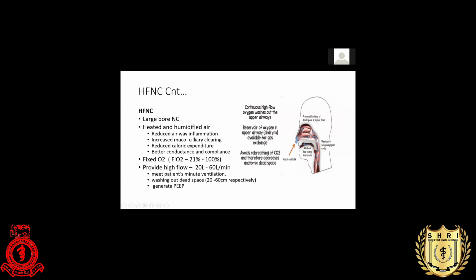And also it washes out the patient's dead space. You see in this diagram, this continuous air will wash out the air in this oropharynx and continuously replace it, and that will help to reduce the dead space. Then this is oxygenated air in this area. And also it will wash out the carbon dioxide, because it dilutes the carbon dioxide in this part, so that will give a good amount of oxygenated air in this part, and that will improve the patient's oxygenation.